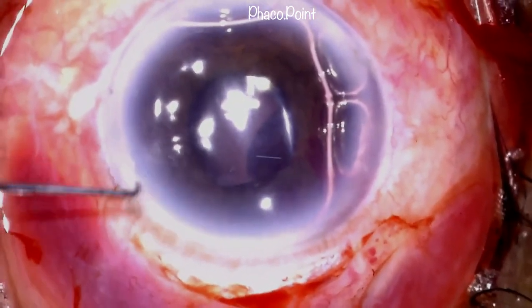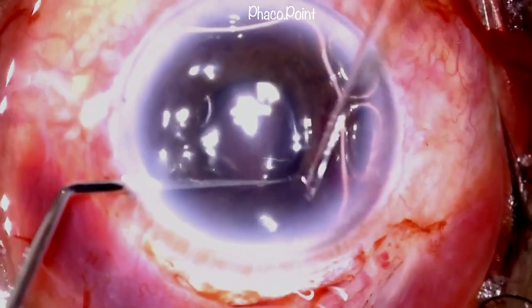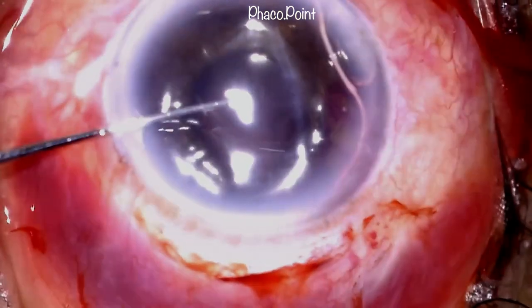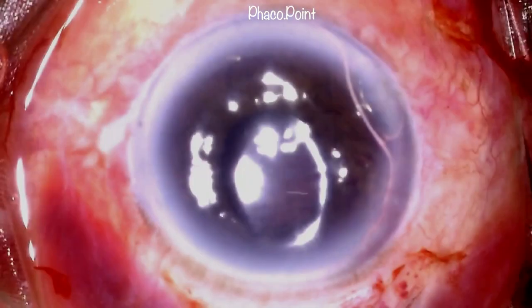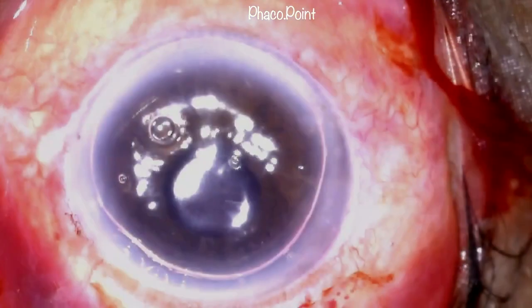As you can see, the superior edge of the optic still seems visible. So now with the help of a Sinsky hook, I rotate the IOL a little bit more to be able to achieve the superior optic edge cover. Following the introduction of some more intracameral pilocarpine, you can see I have a nice, small, round pupil.